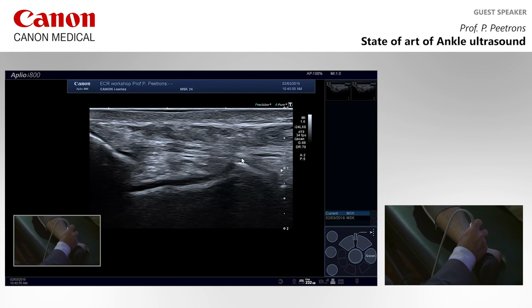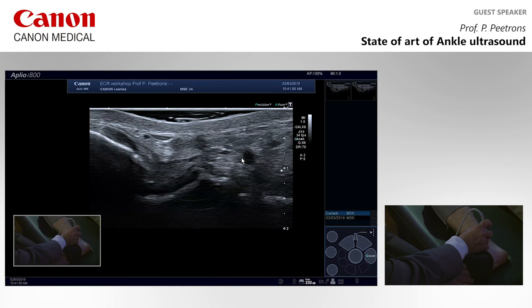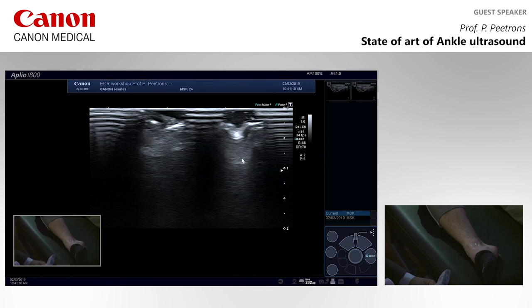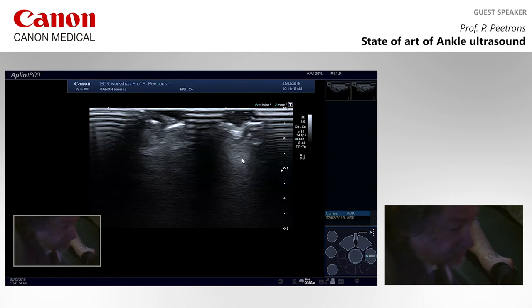If you do the reverse position, impossible to see. If you dorsiflex, impossible to see. It is, however, very difficult to see even when you have the good position, but it's clearly impossible to see when you have the bad position, okay? So it is not the fault of your equipment, it is the fault of your brain, okay?